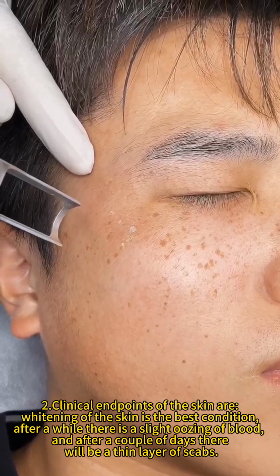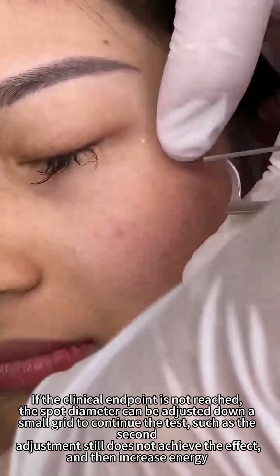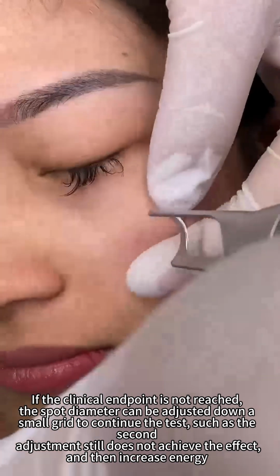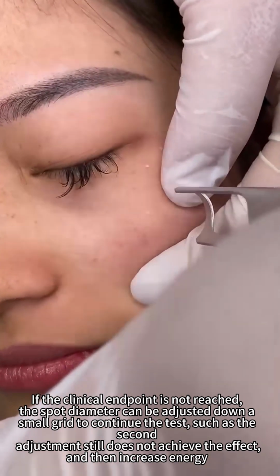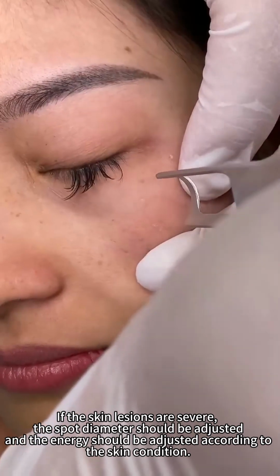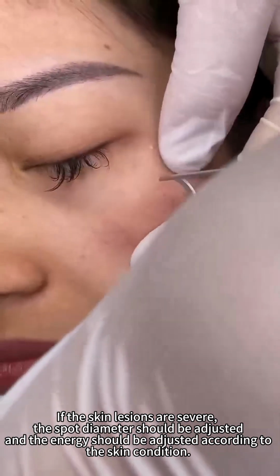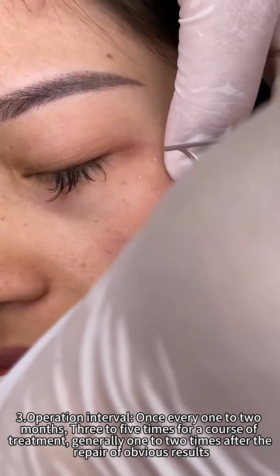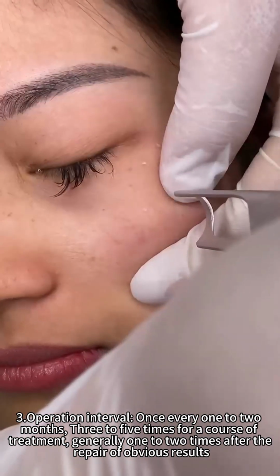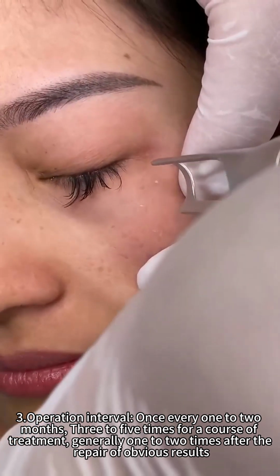thin layer of scabs. If the clinical endpoint is not reached, the spot diameter can be adjusted down a small grid to continue the test. If the second adjustment still does not achieve the effect, then increase energy. If the skin lesions are severe, the spot diameter should be adjusted, and the energy should be adjusted according to the skin condition. Operation interval, once every 1 to 2 months, 3 to 5 times for a course of treatment, generally 1 to 2 times after the repair of obvious results.